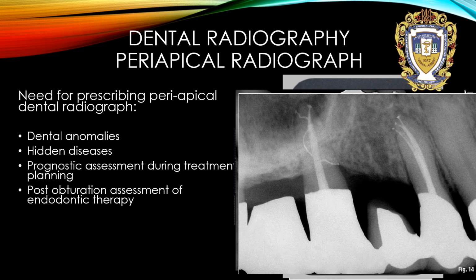You can ask me, what does it mean, this white line? I think it is a fistula, and filling material was passed through the fistula, or maybe additional root canals. I'm not sure.